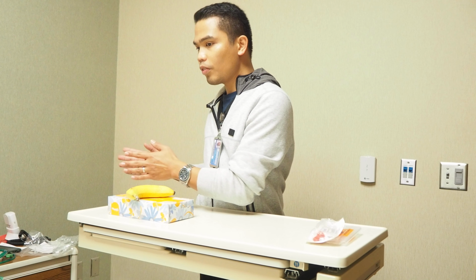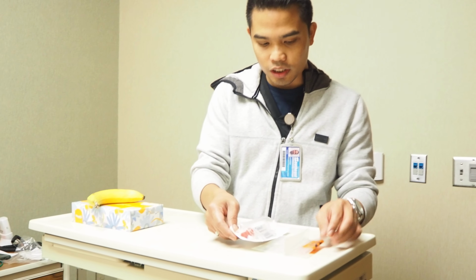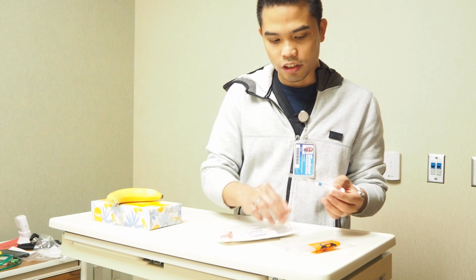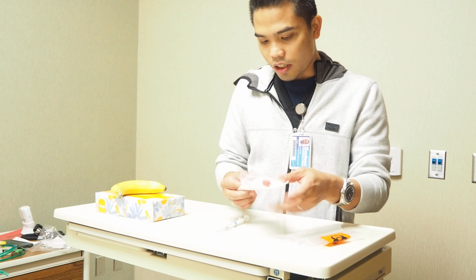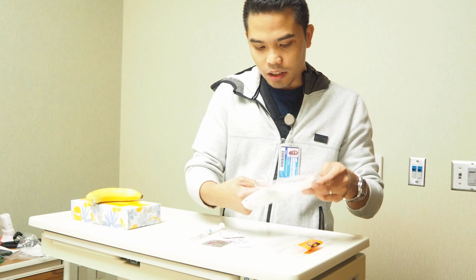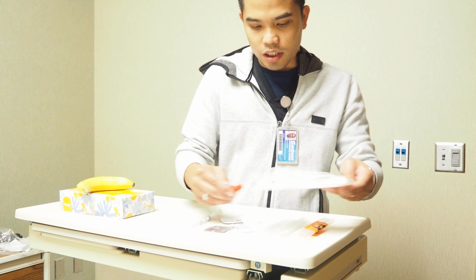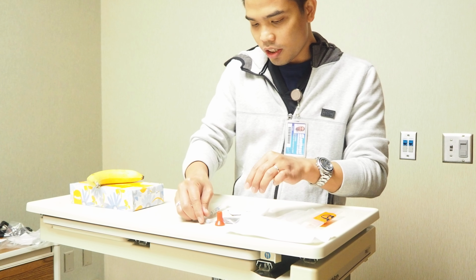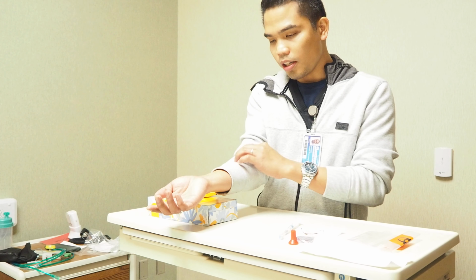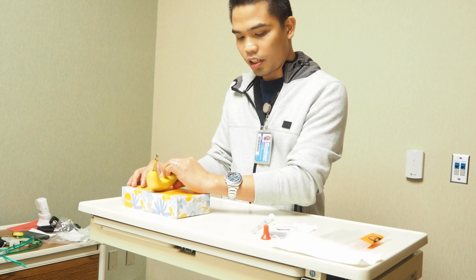Right after I do my modified Allen's test, I'm going to prepare the necessary equipment such as the ABG kit, checking if the necessary supplies are complete: the needle, the alcohol prep pad, the band-aid, the patient's label, the gauze, and even the cap and its stopper. I have to prepare all of this, and once I'm ready, I'm going to reassess again and position the patient's arm like this, and then palpate for the pulse in the radial artery.